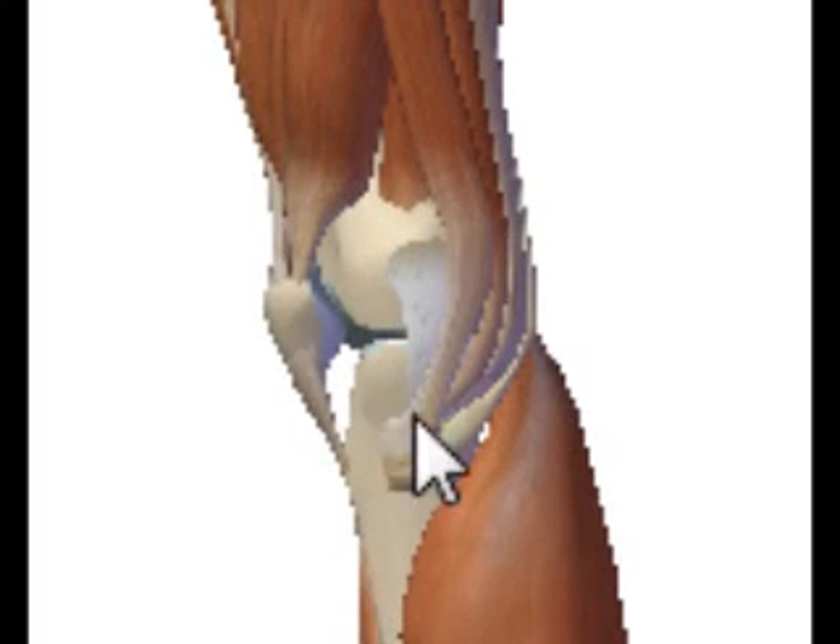That's right at the knee joint most of the time, and if it's not perfect, it's going to be at least very close. You're never going to miss it by aiming at the distal tip of the patella.